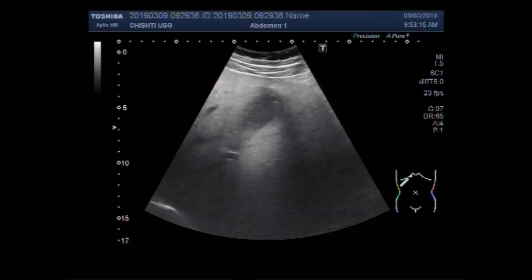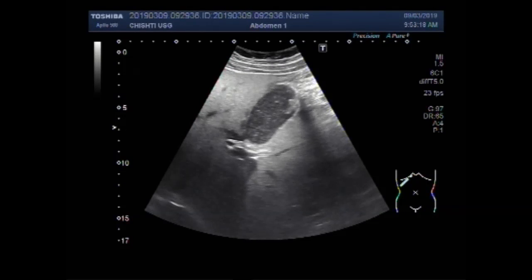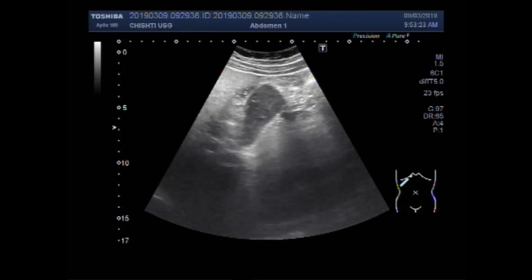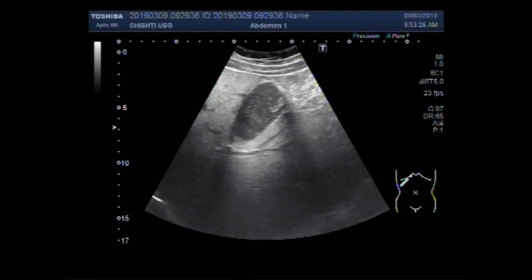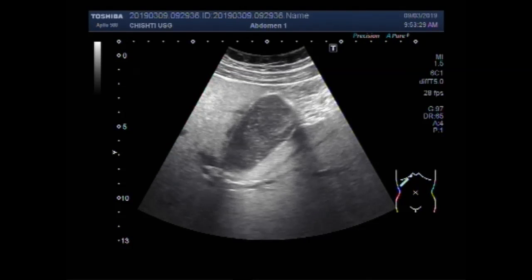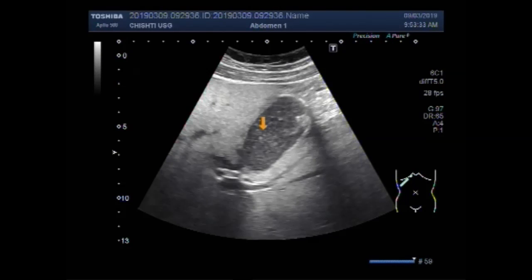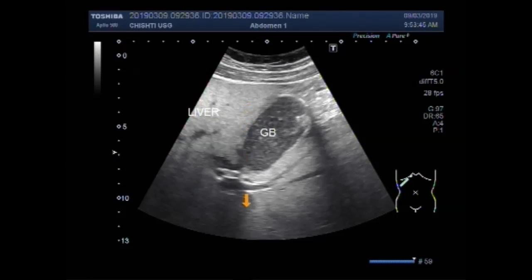You can see a distended gallbladder with accumulation of thick sludge and sand particles. A large stone is also visible in the neck of the gallbladder. This is due to the inappropriate accumulation of mucus in the gallbladder.